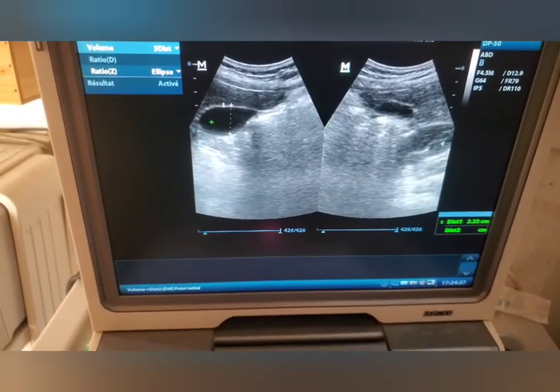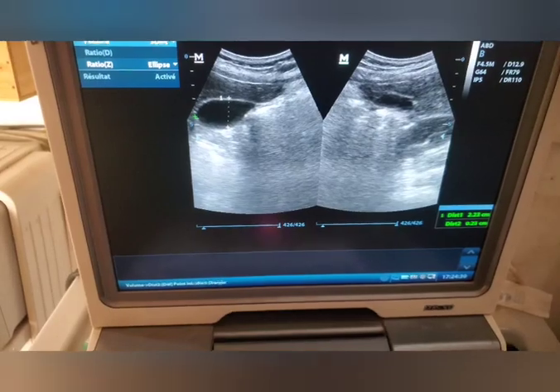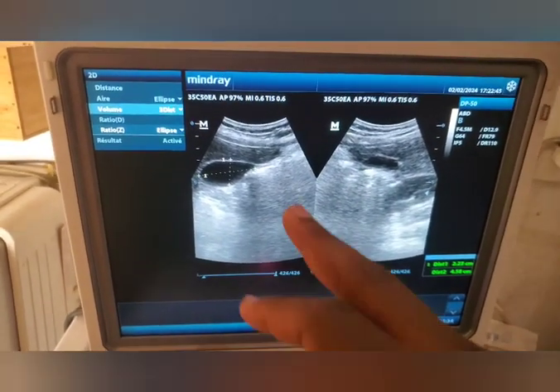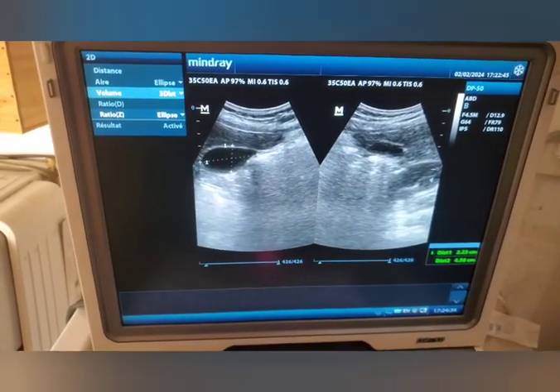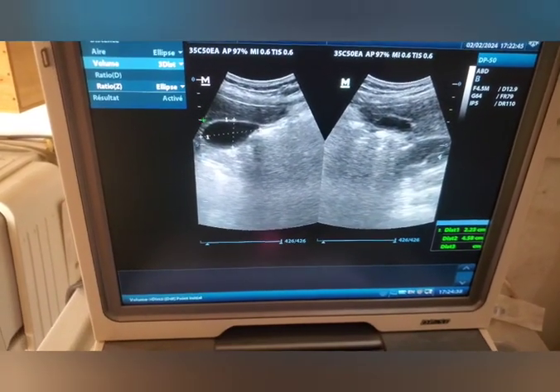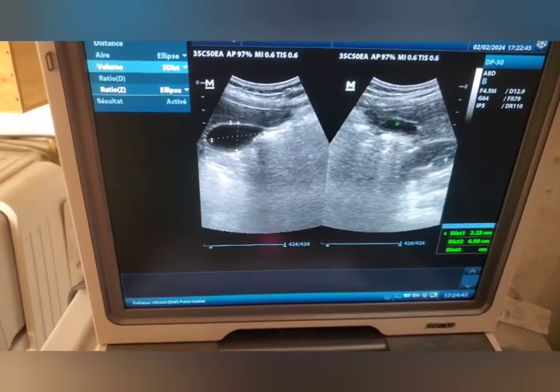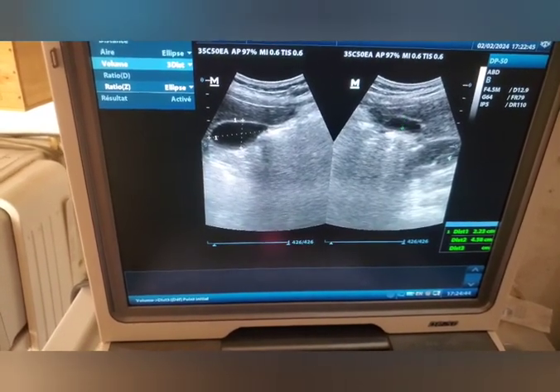Is it clear? Since this image is a longitudinal section, it means it's going to take the height, the distance from here to here. That second distance is the height. Now here you cannot take this distance again from here to here.